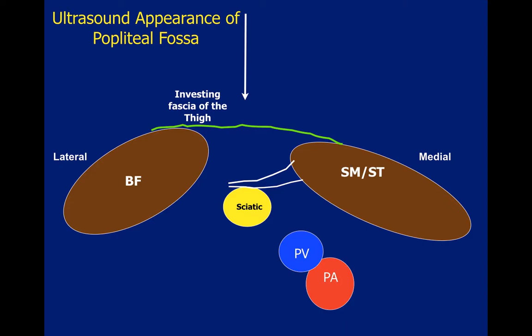We prefer not to approach the nerve directly because inadvertent needle contact may cause trauma or be uncomfortable or injurious to the patient. An alternative to this technique, the direct contact approach, is to position the injecting needle medial to the sciatic nerve. When using this technique, it is important to be mindful of the layers of connective tissue oriented in a coronal plane that may affect distribution of local anesthetic.